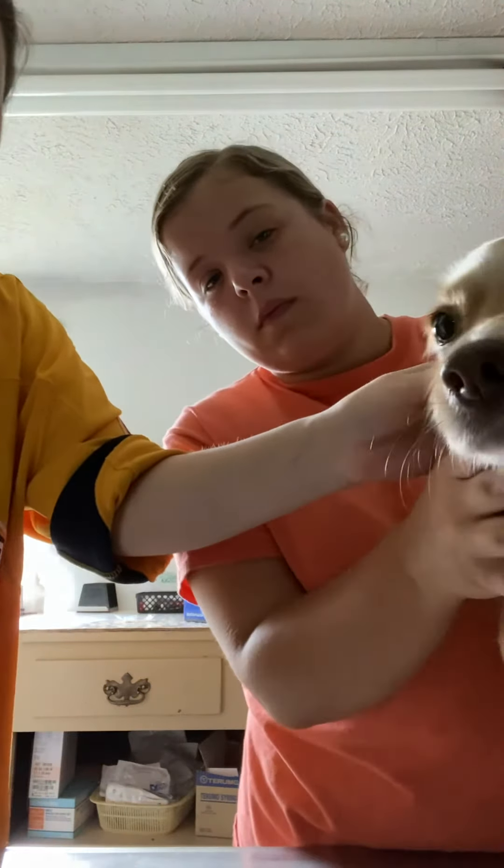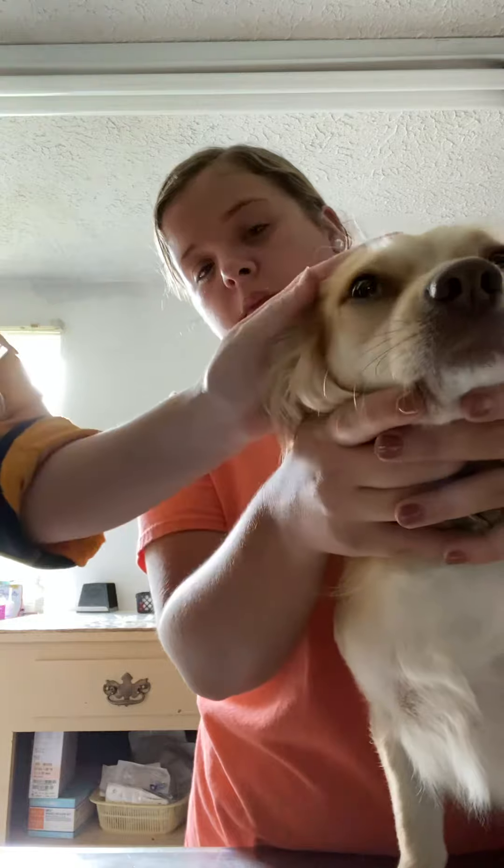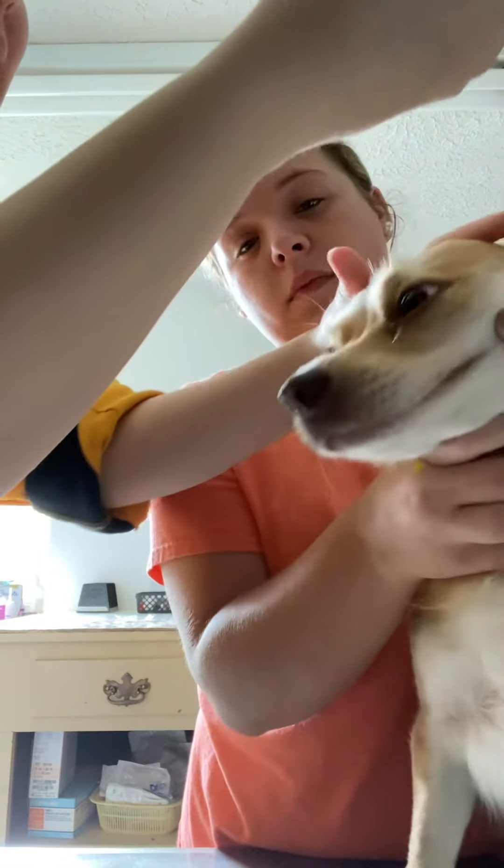And then I'm going to flush the solution. Tilt her head up a little more. Charlie, it's okay. You're okay. Keep her head tilted up.